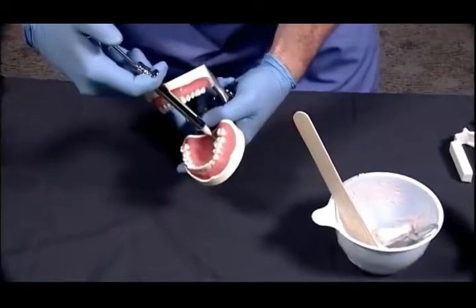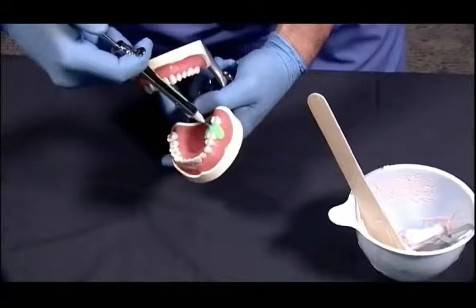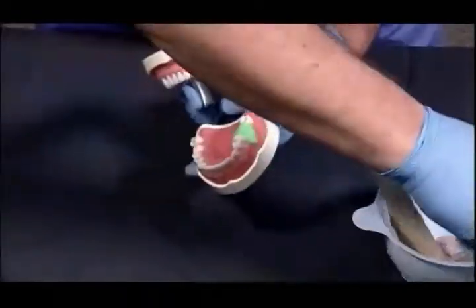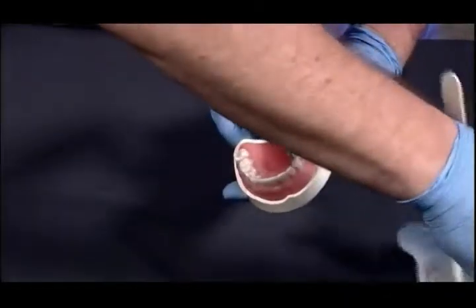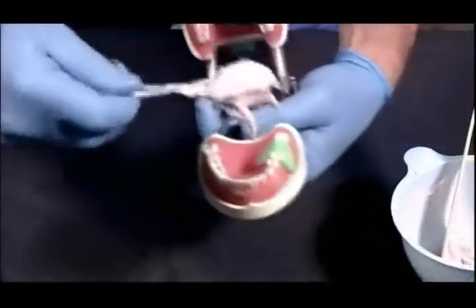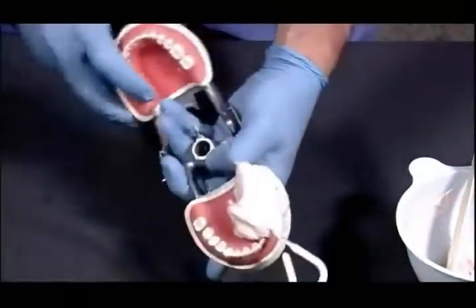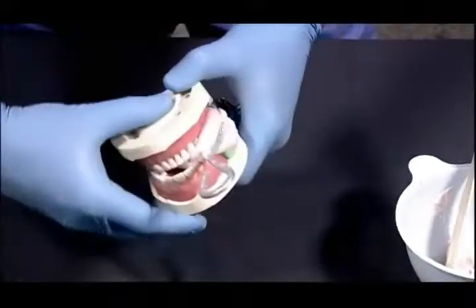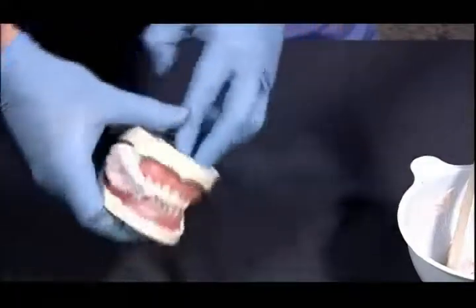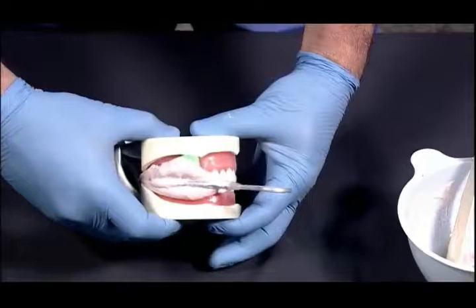So we take the hydrocolloid, impression it around the tooth, making sure that we're getting the details of the margins. Then we'll go back. Your assistant would hand you your impression in the dual arch tray. You place it onto the patient. Go ahead and have the patient close into maximum intercuspation. They don't have to bite down hard. And we have our impression setting up.